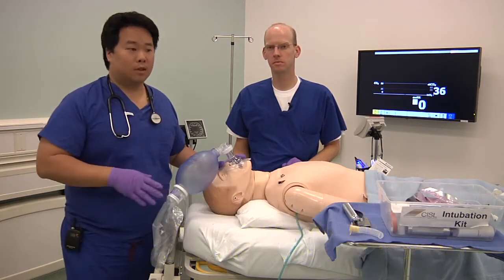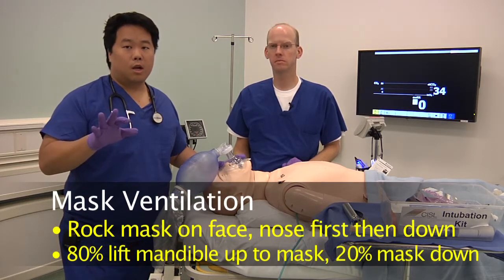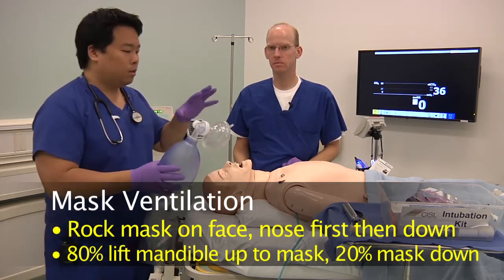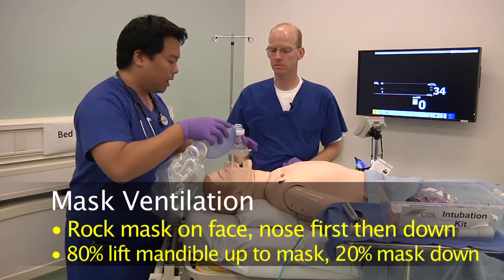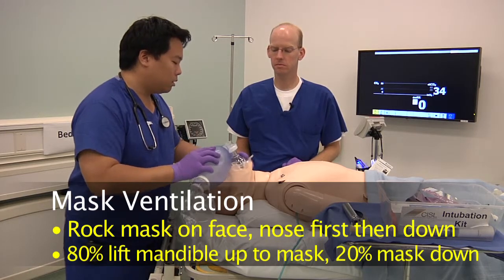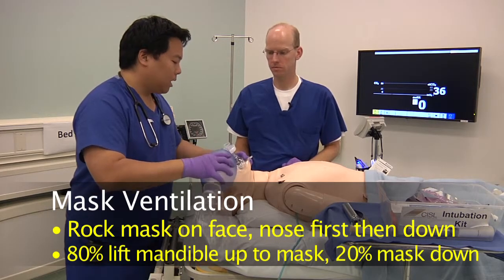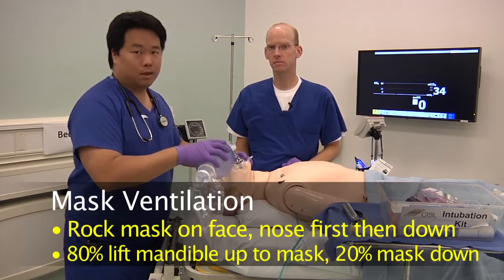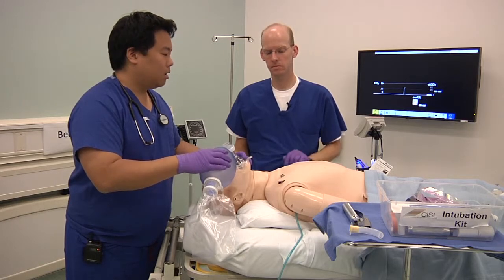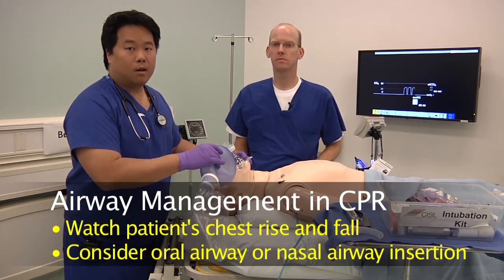Let's actually talk about mask ventilation. This is a very useful technique that can often give you time and bridge the period between apnea and when you can secure the airway. So what we want to do here is to apply the mask to the patient's face, starting at the nose and continue down and tilt down. And then with your fingers here, lift up on the jaw and create a seal. Sometimes you might have to rock back and forth to get a good seal. And then you can go ahead and give a breath. What you want to do is watch the patient's chest rise and fall with each breath so that you are confirming that you can ventilate the patient.